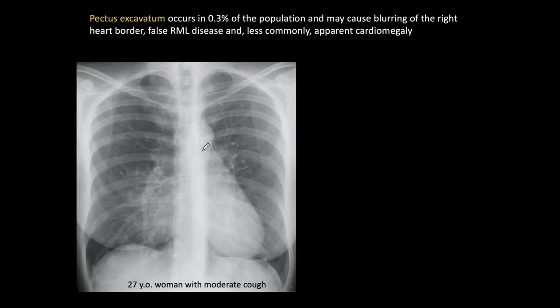Pectus excavatum is the third normal variant I want to talk about. It's fairly common, occurring in about 0.3% of the population, and can give several manifestations. The most common is blurring of the right heart border, and sometimes it can produce an opacity in the area of the right middle lobe, simulating right middle lobe disease.